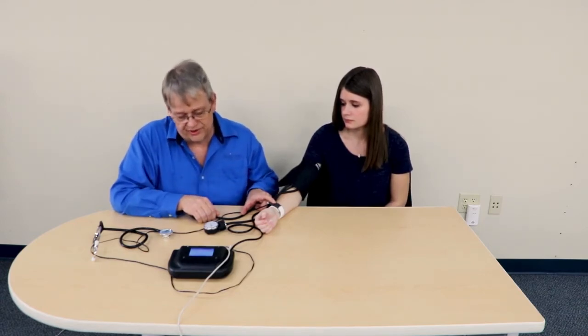I feel the pulse now at 120 — this is Korotkoff I sound. I reduce the pressure below 110 and the Korotkoff II sound starts — it's a slightly longer swoosh sound. Below 100, Korotkoff III sound starts — it's more like Korotkoff I, just not as loud. Finally, Korotkoff IV sound is even more muted, about the same as III but slightly more muted, and I can still feel the pulse. Once we get below diastolic, I can still feel the pulse but the Korotkoff sound goes away. So this reading was 120 over 80 with no auscultation gap.